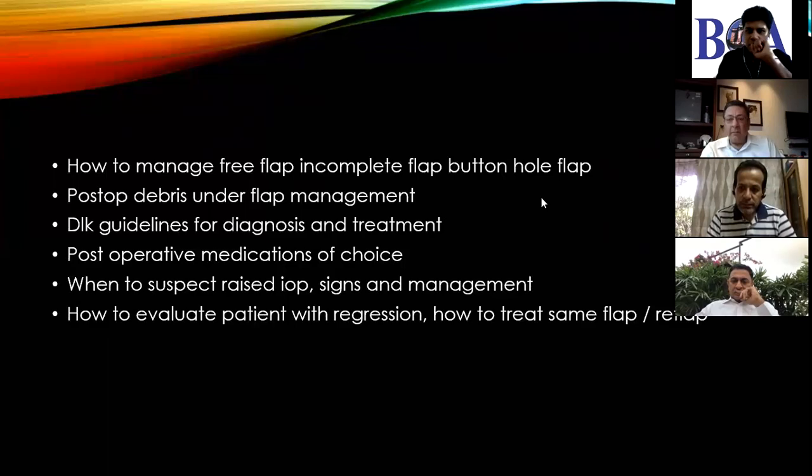I think so. We have two views on this. Himanshu, can you take the buttonhole, please? Yes, I'll take the buttonhole. I just wanted to add that I would agree with Berger. I would abort the case. And I'll give you one more example of a partial flap with a femto. It's 100 micron, 110 micron. I would abort it, or if the OBL is out, I can go ahead with a microkeratome blade with a 140.